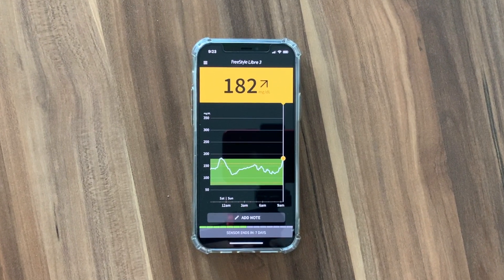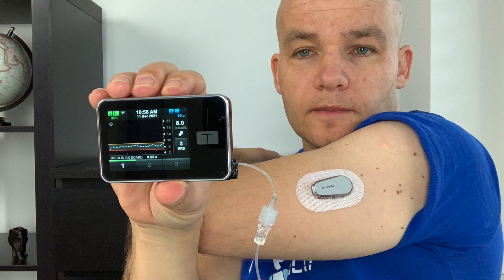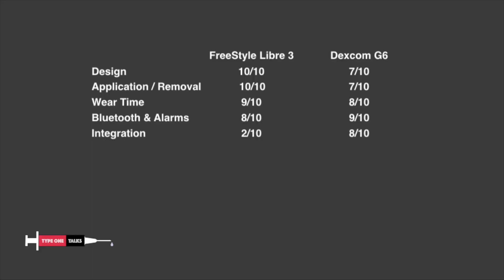Libre 3 has no dedicated reader and when it comes to Apple Watch, the only thing I can get there is a push low/high alarm notification. Another thing that I absolutely love about Dexcom G6 is that I can use it as part of a commercial closed loop insulin delivery solution with my Tandem T-Slim X2 insulin pump. At the beginning of 2022, Dexcom G6 is the only CGM solution on the market that offers this kind of integration and commercial closed loop. Libre 3 should be able to do it in the future but we don't know when. That's why I give Libre 3 only 2 out of 10 and Dexcom G6 8 out of 10 for integration with other devices. Hopefully Freestyle Libre 3 will improve in the future.